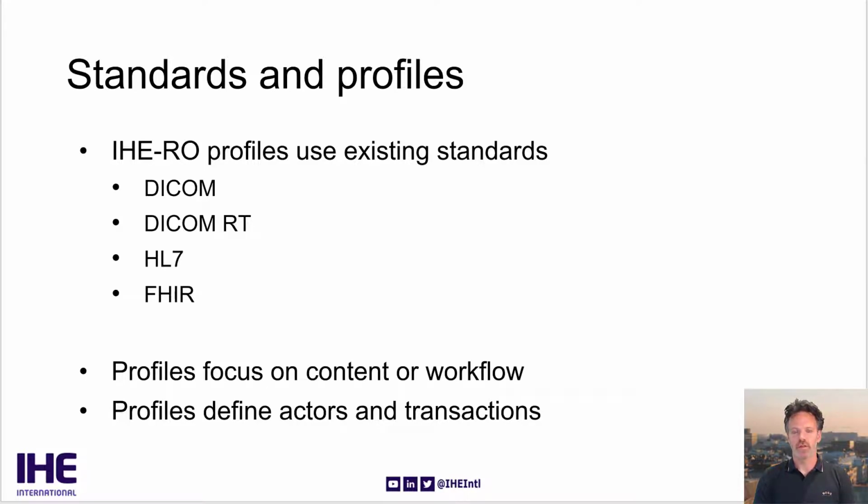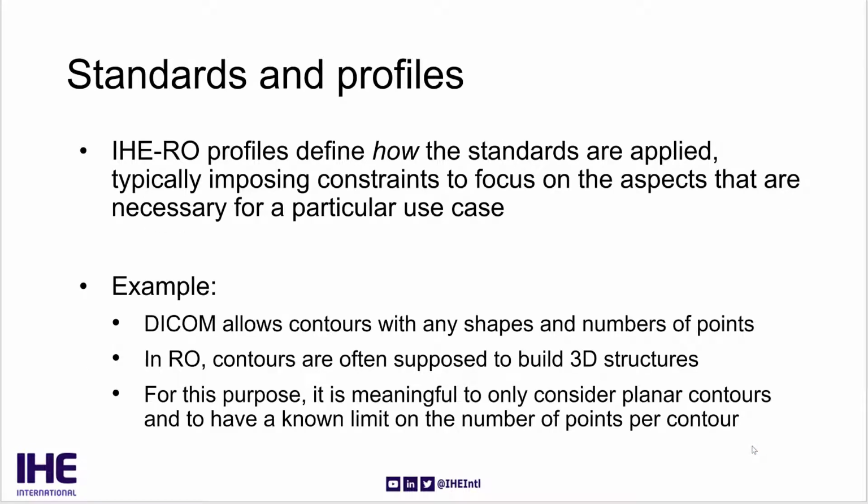The standards are used, and they broadly define what's possible to communicate. But the profiles that IHE-RO works with focus on which specific content should be included and also what the workflow should be. The profiles define various actors and transactions that are necessary to achieve a use case. IHE-RO profiles define how the standards are applied, typically by limiting how the standards are used, imposing constraints to focus on the aspects that are necessary for a particular use case.